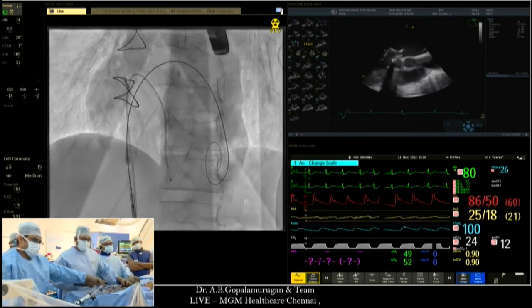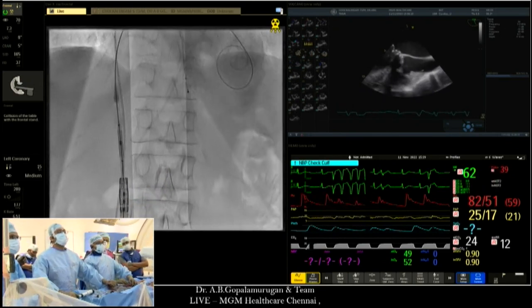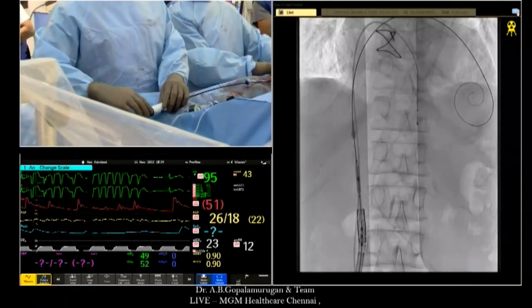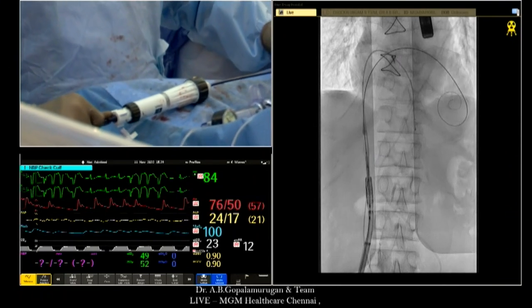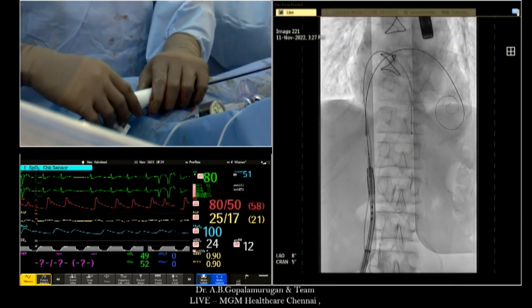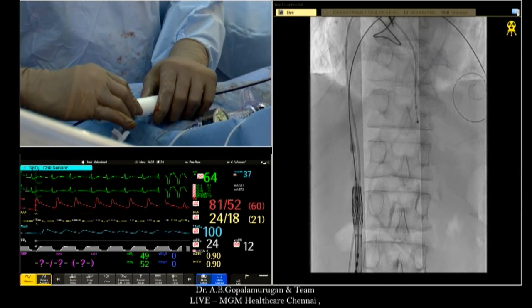Gopal, one question. Hi. Show me the valve. You said you are going to use a 26 Sapien. And if needed, you might go up on the size. But the Sapien does not usually go up as required. No. Not as required. You can happily take a 26 up to 27, 28 also. There is enough coaptation depth on the leaflets, so you can just add volume as you need. That's fine. I'm just loading the valve, as you can see, in the IVC.